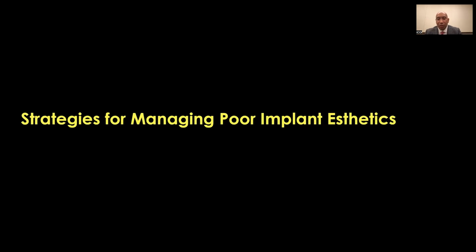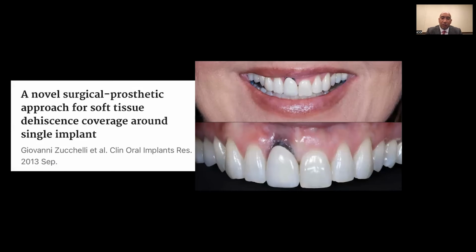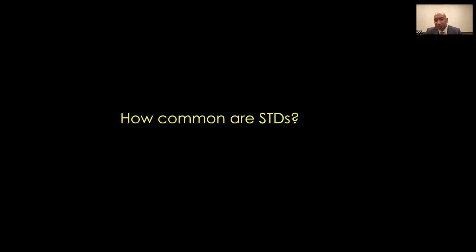So what are some strategies for managing poor implant aesthetics? Let's talk about soft tissue dehiscences, or STDs. Now, STDs, I think it was coined by Giovanni Zucchelli. I've given him credit for it. If I get it wrong, let me know. But I believe he talks about STDs first, and sometimes he calls them PSTDs, peri-implant soft tissue dehiscences. If you just wanted to call it gingival recession on an implant, I would be totally fine with that.